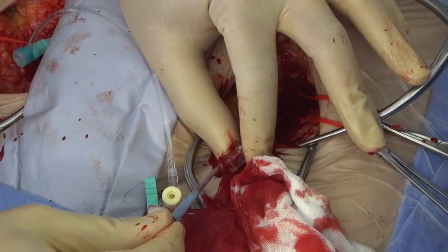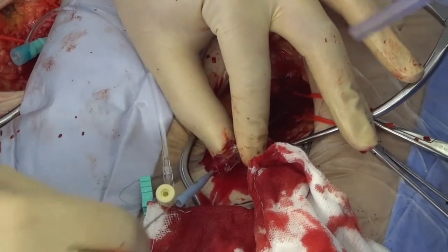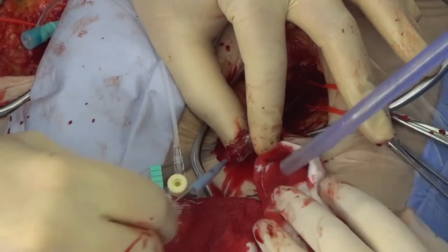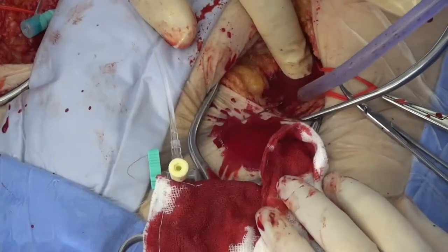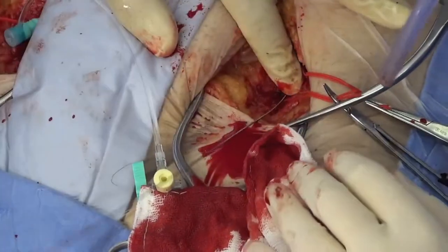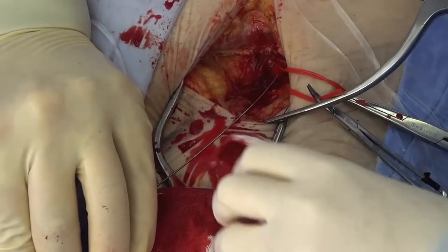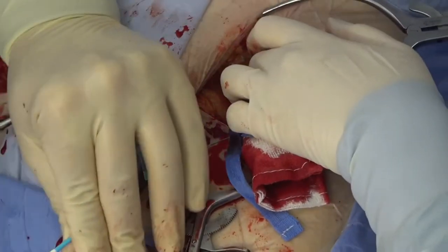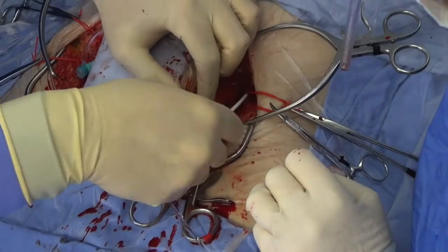The same procedure is followed on the contralateral femoral artery. After this has been completed, access has been created through both femoral arteries into the abdominal part of the arterial system.